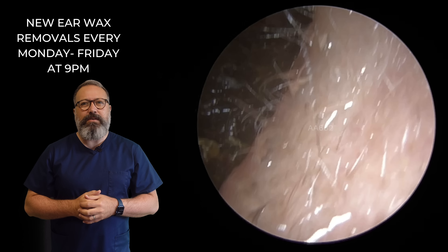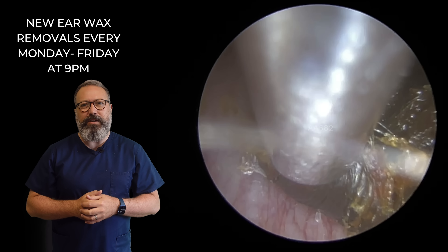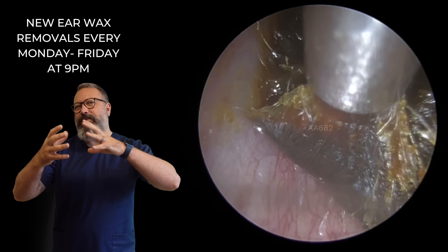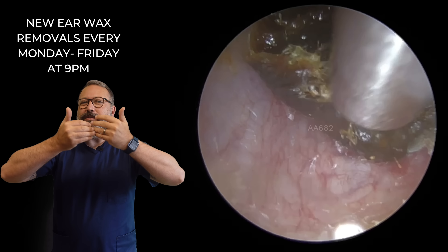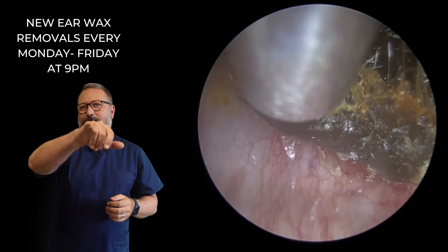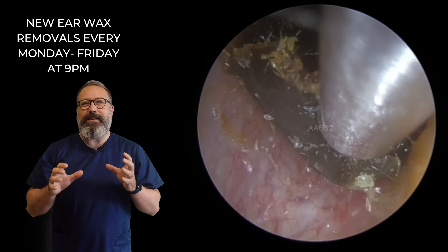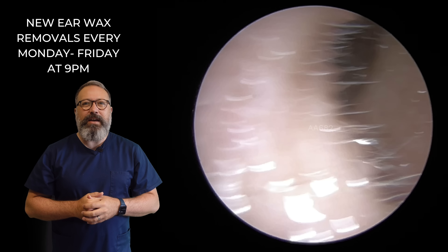Let's go back in and have a little look — we can just see a couple of little bits got sucked inside the tube there, so we just cleared that out. But you can really get a good look at that thicker underlayer there, just as we're lifting up — it sort of rounds over as we're lifting, and that's when you know it's really sticky old stuff. When it starts detaching a little bit more freely, which is just what you can see happening there, that's when we know we're really getting to the nub of this one. So we're just lifting around the sides.